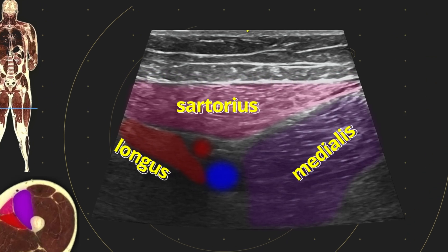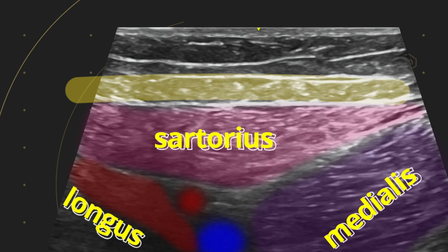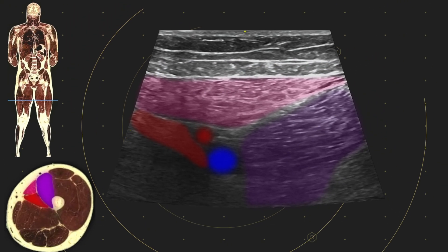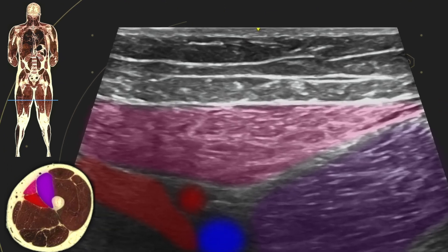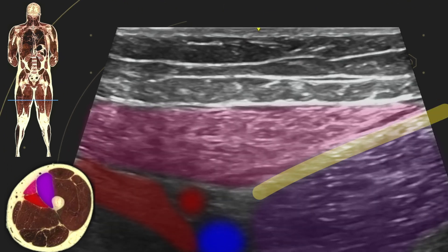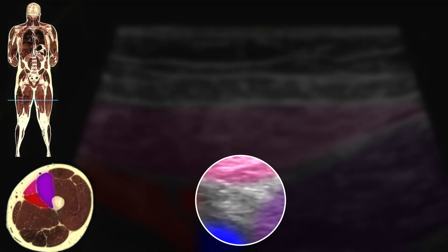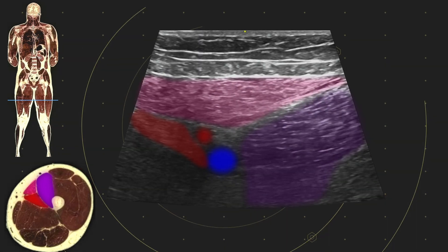We've also looked at a couple of areas. We've looked on top, within the fascia lata, for the anterior femoral cutaneous branches. We've looked below the fascia, looking for branches of the nerve to vastus medialis. And we've looked for the saphenous last of all, and we're thinking about a safe approach.